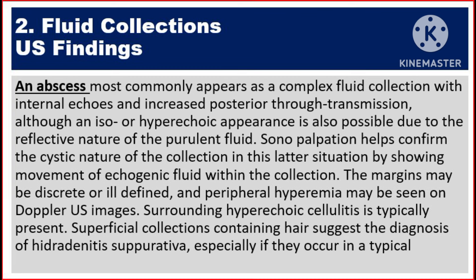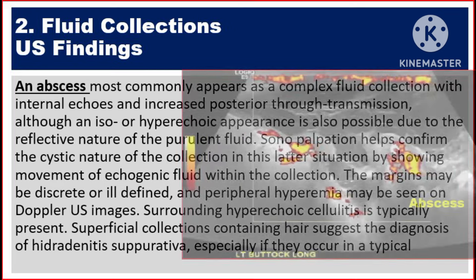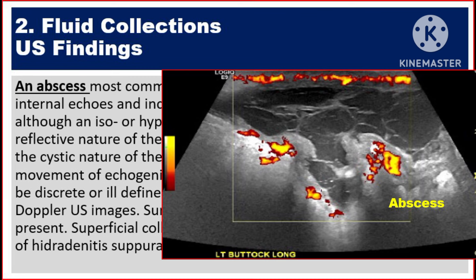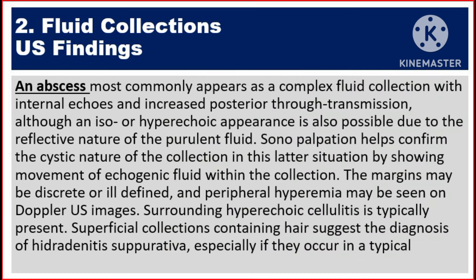Ultrasound findings. An abscess most commonly appears as a complex fluid collection with internal echoes and increased posterior through transmission. Although an iso- or hyper-echoic appearance is also possible due to the reflective nature of the purulent fluid. Sonopalpation helps confirm the cystic nature of the collection by showing movement of echogenic fluid within the collection. The margins may be discrete or ill-defined, and peripheral hyperemia may be seen on Doppler ultrasound images.